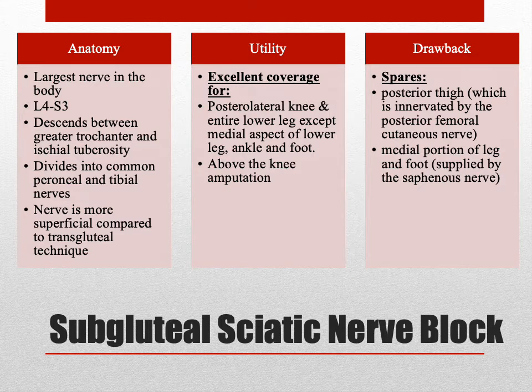As mentioned before, the posterior thigh is spared when using this technique. If you'd like to get coverage of the posterior thigh, the transgluteal approach to the sciatic nerve would be appropriate.